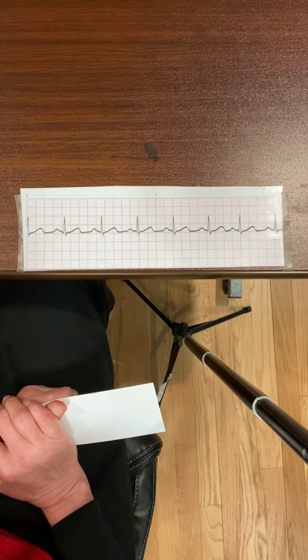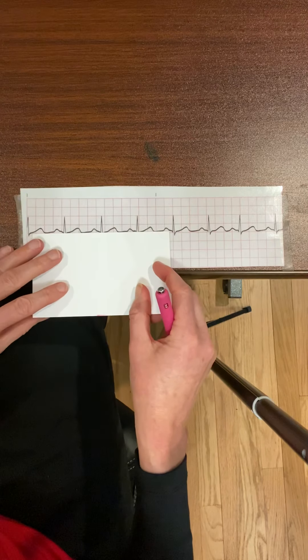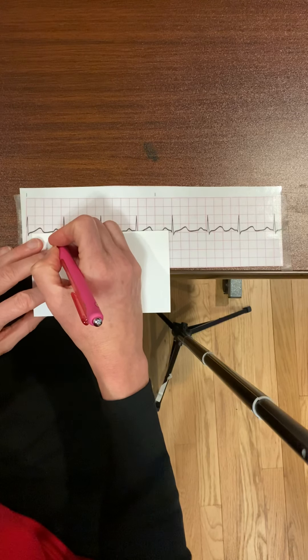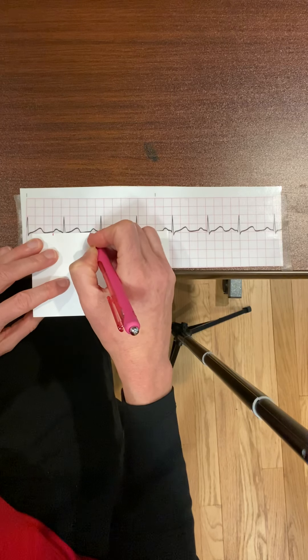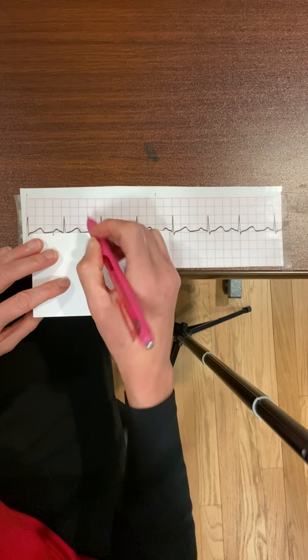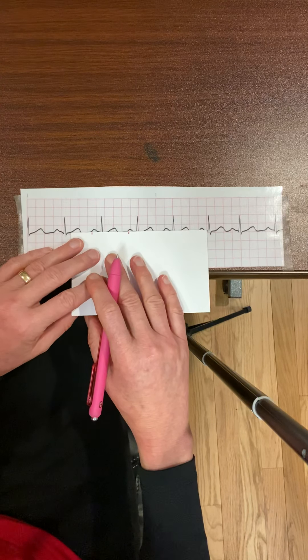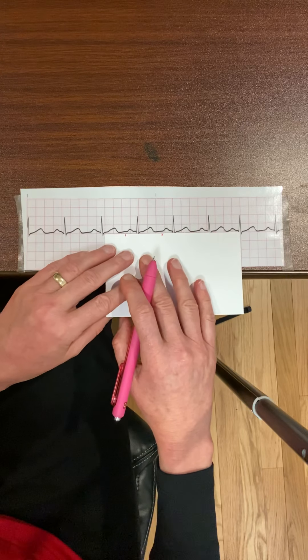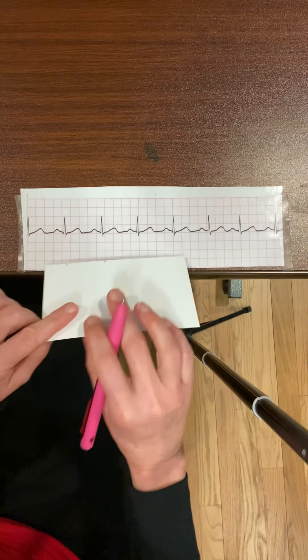The next thing I need to determine is if this rhythm strip is regular. I'm going to check my atrial rhythm first. What I like to do is put a little line right at the beginning of the P waves, and then simply walk it out to see that my P waves are all marching out. My atrial rhythm is regular.